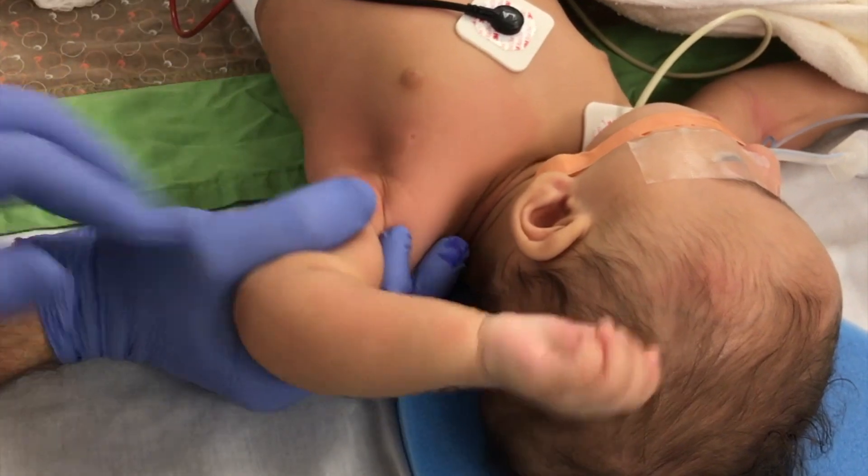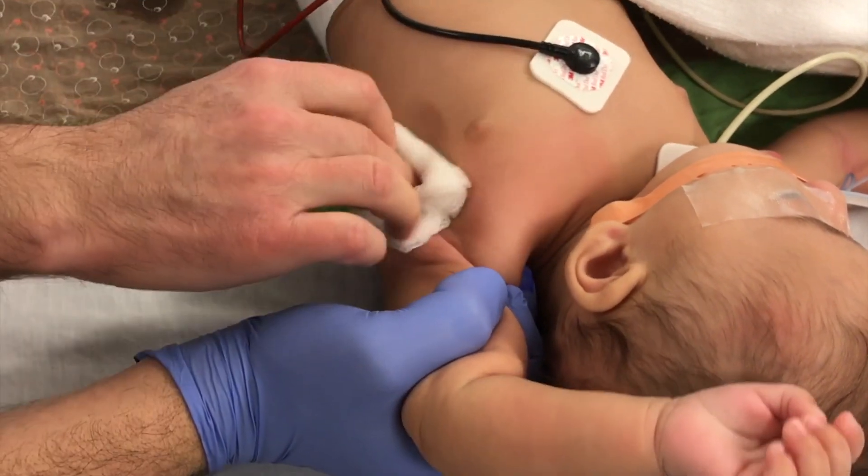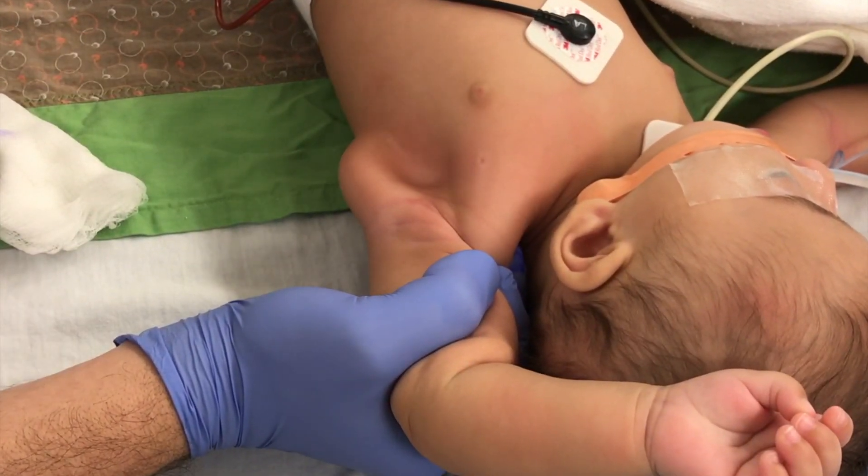Finally, the subscapularis is injected by abducting, externally rotating, and forcing the scapula away from the body.